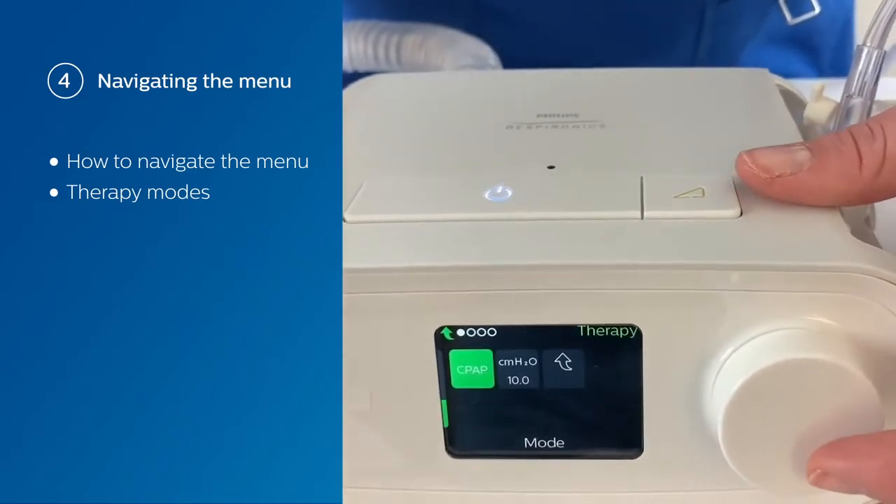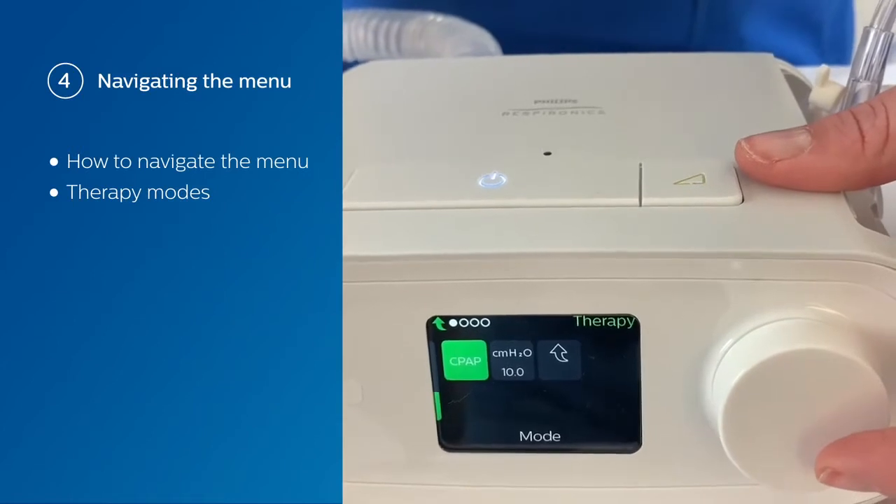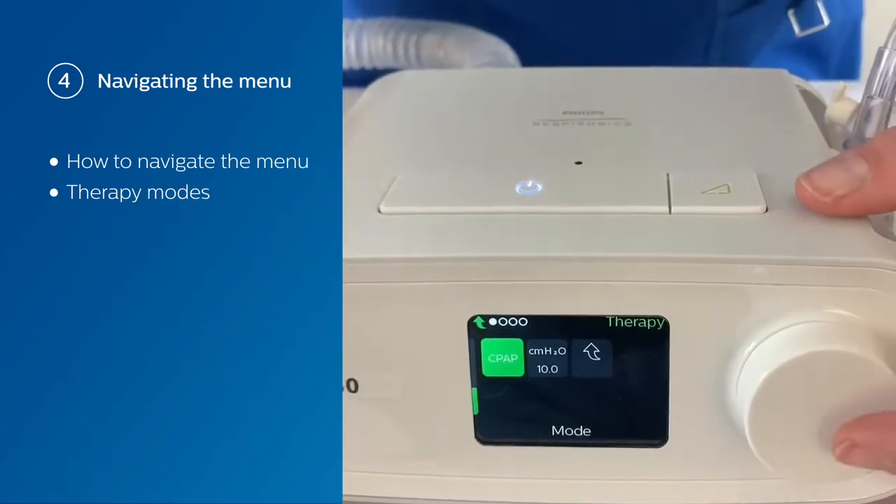Now, CPAP. In CPAP, you only set one pressure — that's your continuous positive airway pressure.